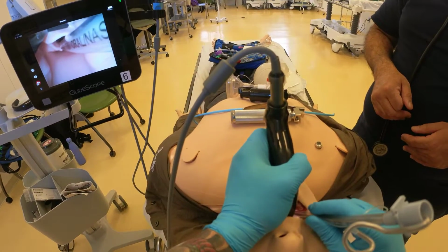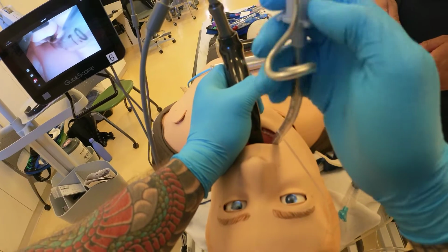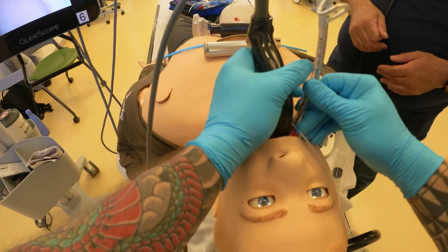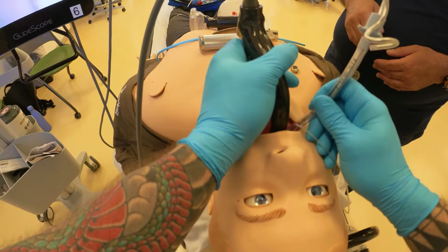And what you do is, if this is rigid and you can't advance, you can pop your stylet up and make the tip softer. And this will allow you to advance the tube forward if you need to. What I do is I note my depth. So here I have it to be roughly at 19. I'll go a little bit further, 20 at the lips.